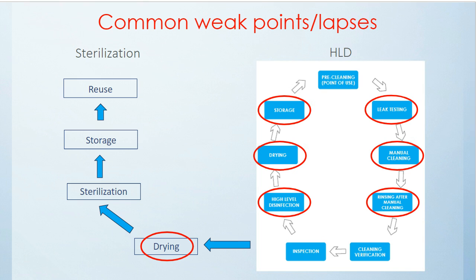Drying, we talked about drying and looking at making sure that we're either putting the scope into a drying cabinet or we're flushing with the 10 minutes of compressed air, minimum HEPA filtered quality air to dry those endoscopes. And the document does say that if you're doing a manual drying process, like using a drying pump, that you should, so it's a recommendation, periodically do a drying indicator test on it. That shows that your drying process is under control. It's all about quality parameters and demonstrating that your process remains under control, because historically we've had very little in the way of feedback mechanisms for high-level disinfection.